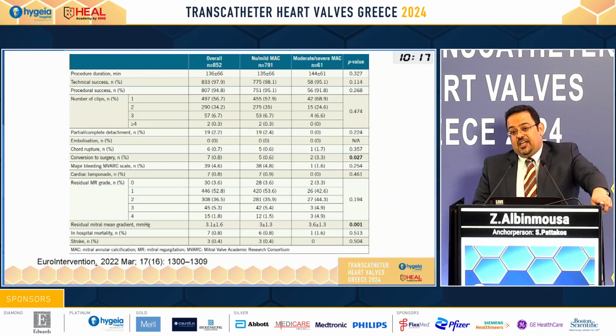So you have to be careful dealing with such patients with mitral valve TEER.